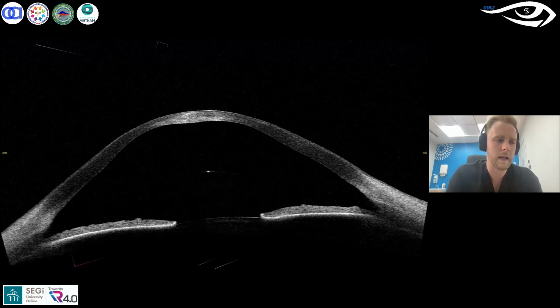I know that especially in the earlier days when I started working at Moorfields, dealing with keratoconic patients, quite often you would look at the notes and see keratoconus and think, what am I going to do? Am I going to do an autorefractor? Am I going to try retinoscopy? The idea of this is to give everyone a good starting point so that the anxiety isn't there whenever you do see these keratoconic patients.